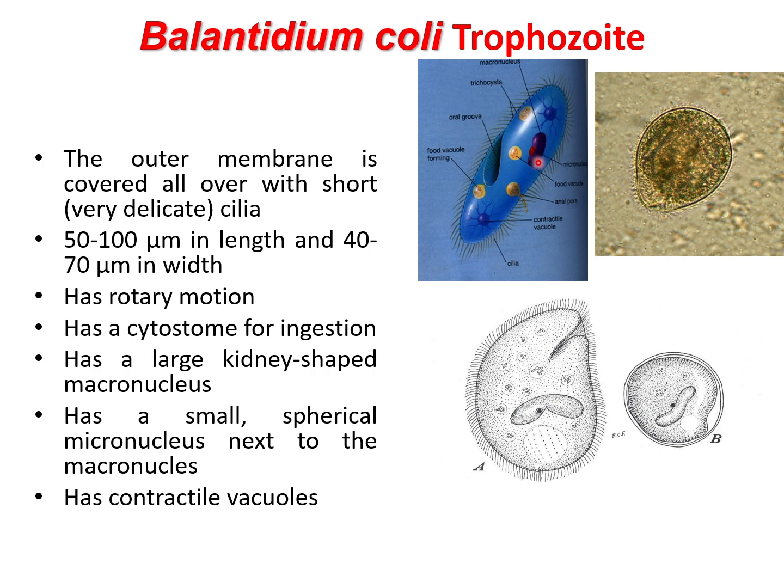We can see in these parasites two nuclei, a macronucleus that has a bean-shaped dimension and that is involved in all the metabolic regulation of the parasite, and the small micronucleus, which is in red here. This micronucleus is located in the constriction of the bean-shaped macronucleus, and this micronucleus is responsible for reproductive activities. So when you isolate a trophozoite of Balantidium coli in the freshly isolated stool from an infected patient, you can see the cilia that characterize the external surface of this parasite.